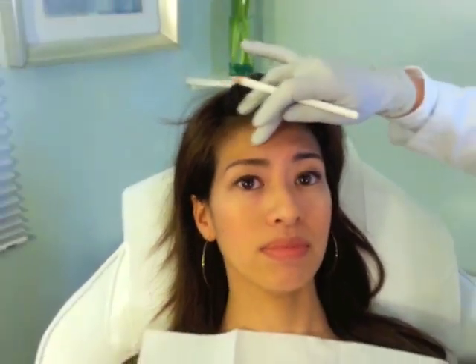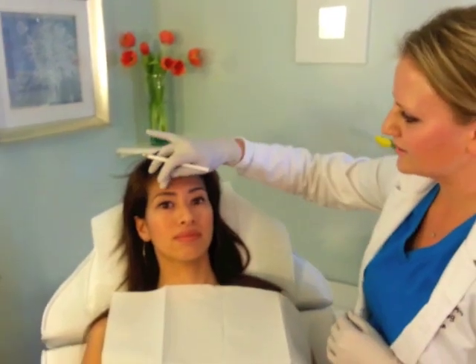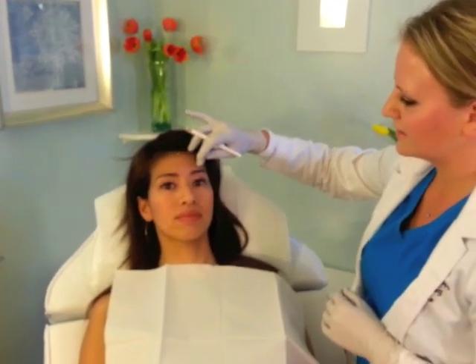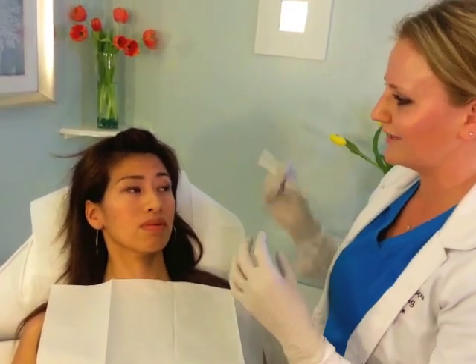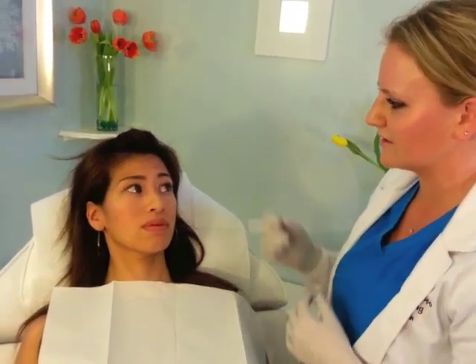Just right there in the center. So what I'm going to do is actually inject the glabellar region, which is made up of several different muscles. I'm going to get all of those muscles and try to relax them so it relaxes the movement that causes those lines that you're concerned about.